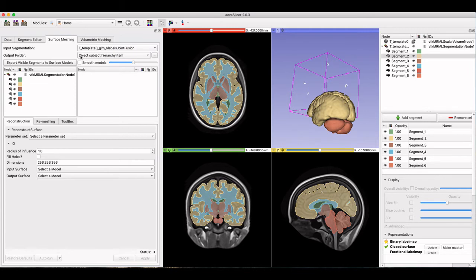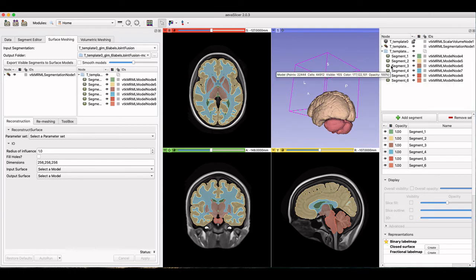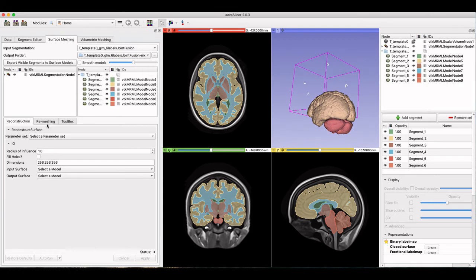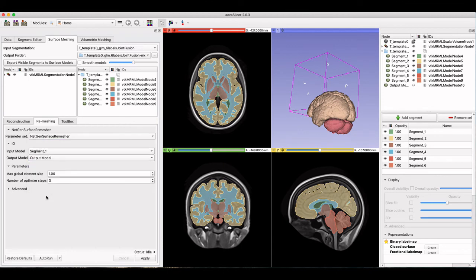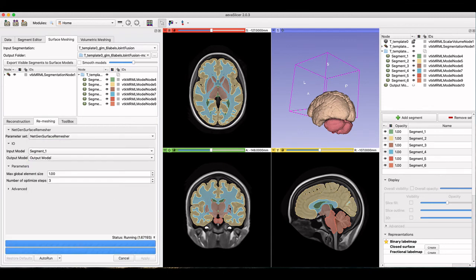Next, since the segmentation is complete from previous work on the Mindboggle project, I can export the segmentations to surface meshes. I chose not to smooth the models in this case because they are already smoothed, but that is helpful to smooth the output surface from an initial segmentation. The level can be adjusted with the slider bar.